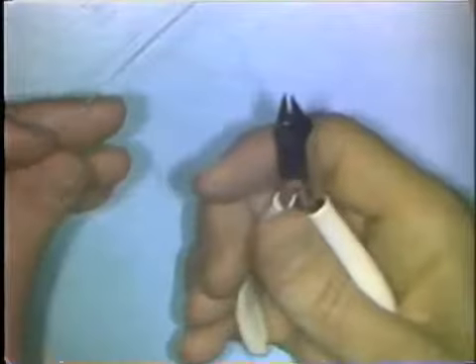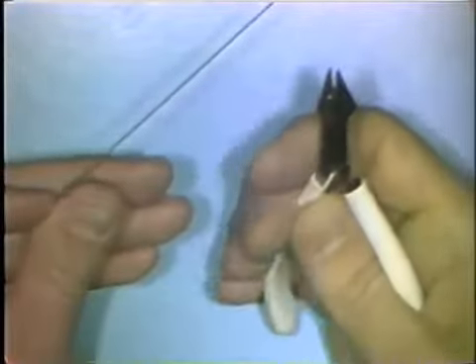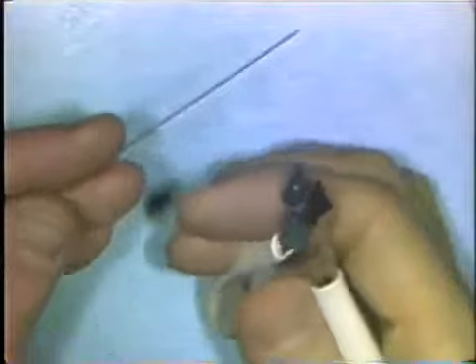To make a right angle bend, you hold the 139 bird beak pliers in your right hand, if you're right-handed, with the round beak away from you. You place the wire between the beaks of the plier so that the diameter of the wire to be bent is smaller than the diameter of the round beak that it's contacting. Bending too large a wire in a 139 plier may damage the beaks of the plier.